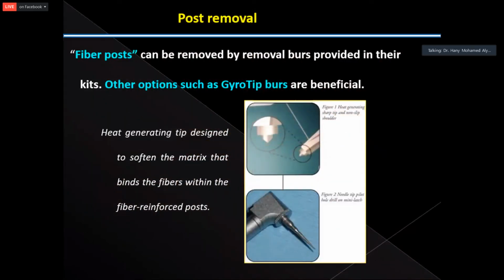For removal of fiber posts, there are some burs which are designed in order to remove these posts, such as the Gyro Tip burs.